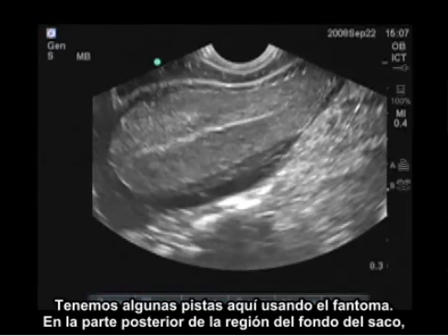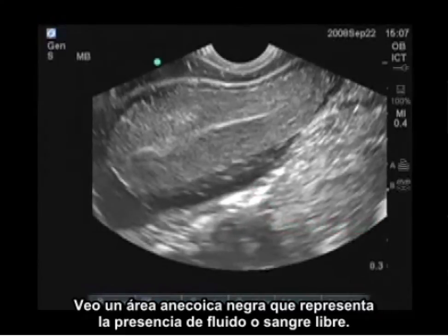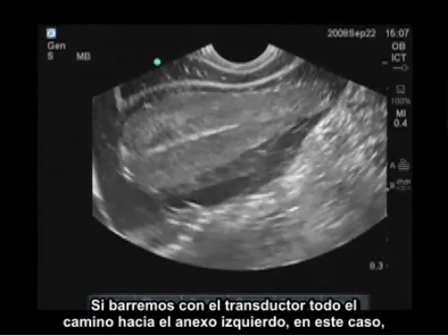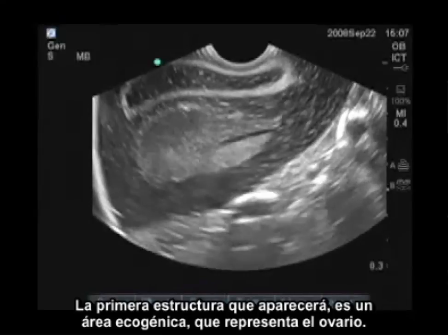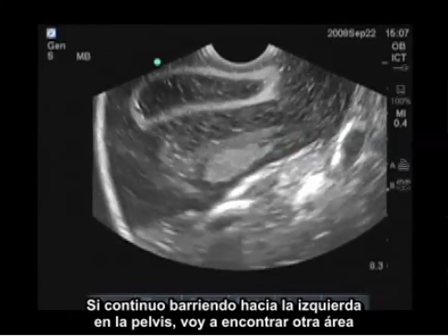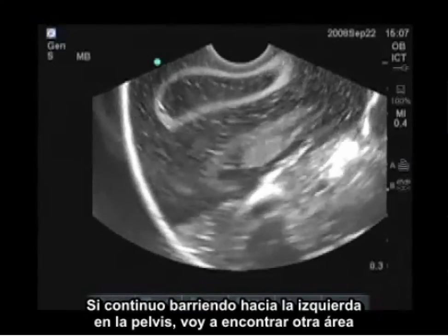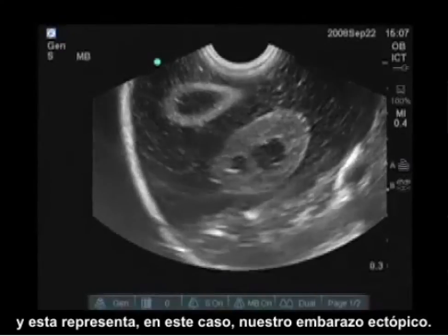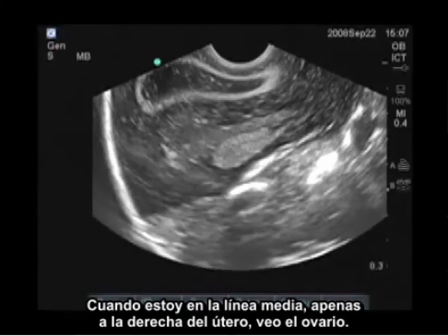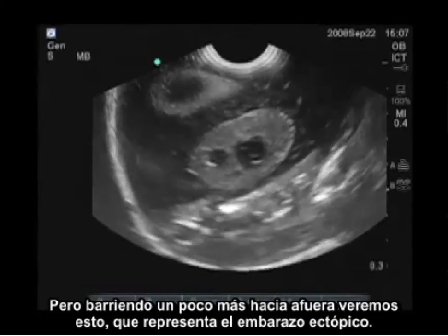I do have some hints using this phantom. In the posterior cul-de-sac region, I'm seeing a black anechoic area, which would represent free fluid or blood. If I scan all the way over to the left adnexa in this case, the first structure I come across — this echogenic area — represents the ovary. If I keep scanning to the left in the pelvis, I encounter another area, and this represents, in this case, our ectopic pregnancy. When I'm medial, just right beside the uterus, I see the ovary, and scanning out a little bit more reveals the ectopic pregnancy.